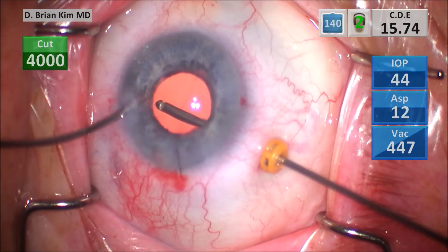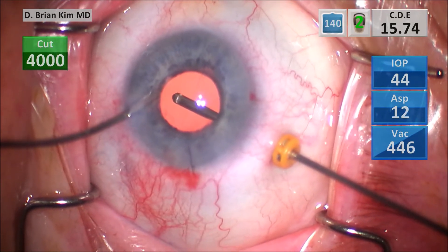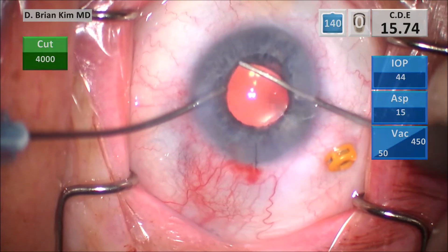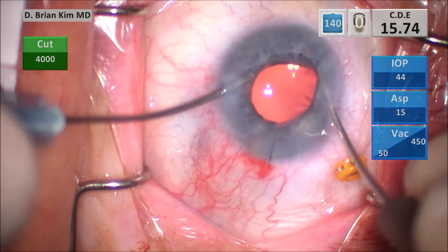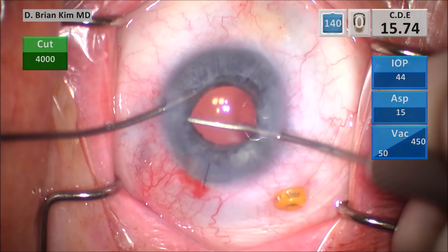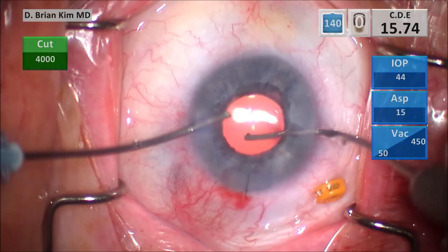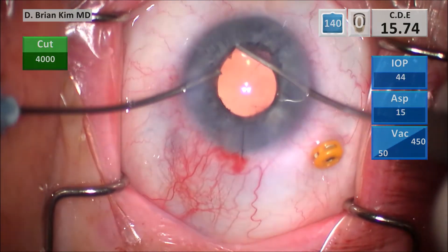The AC cannula is a 20-gauge AC cannula; it maintains high infusion pressure. I keep the cannula in, take the vitrector out, and then with infusion on I use the Lester hook to make sure I'm achieving optic capture still — ensuring and confirming I'm keeping that buttonhole configuration of the optic through the rhexis edge. Because I removed that vitreous, you can see how deep the chamber is.